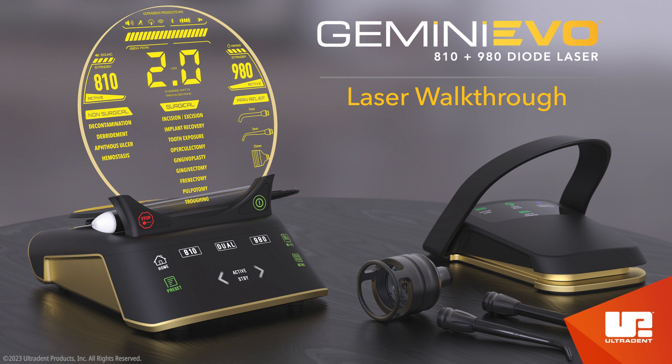As always, read the user's manual thoroughly before using your Gemini Evo Diode Laser. If you have any questions, please contact your Territory Area Manager, Customer Service Representative, or Equipment Support Team for assistance.